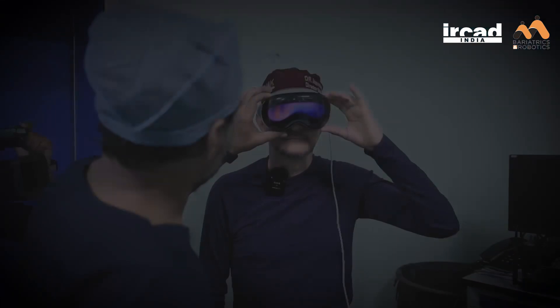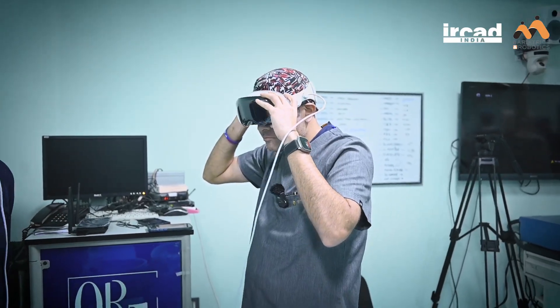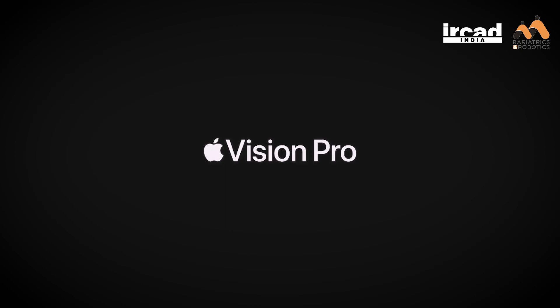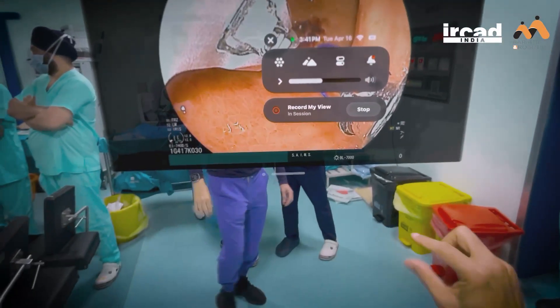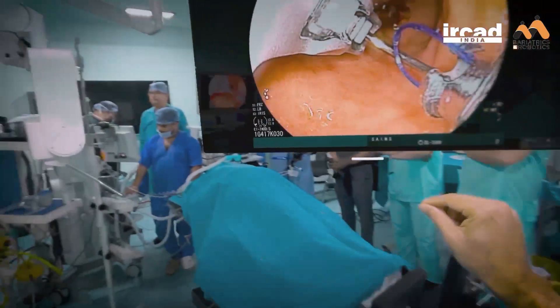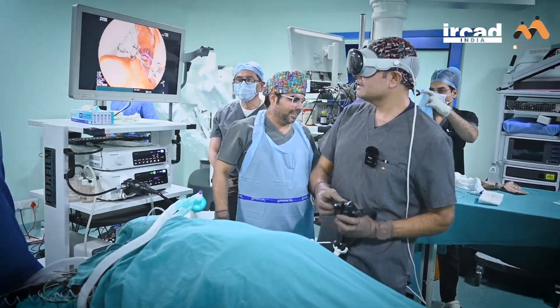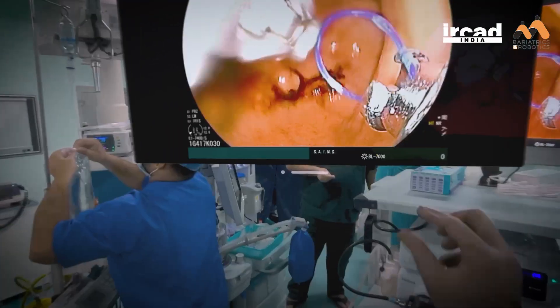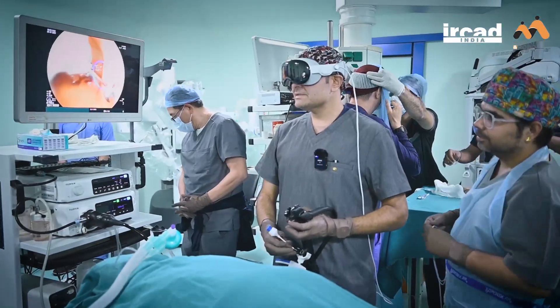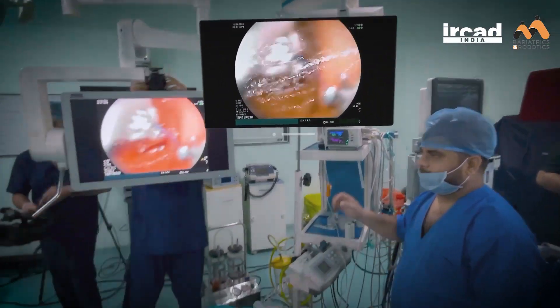What we are doing now is making a practical use of the Apple Vision Pro in a surgical field. The image we have is the same or even better than what we see on our own screen. I'll just take the first layer. The beautiful thing here is I am able to position the image, decrease the size of the image, bring it close to me, bring it away — everything I am able to do.